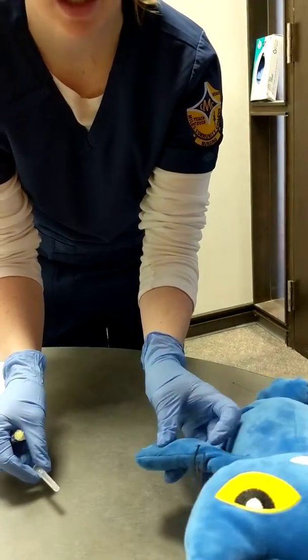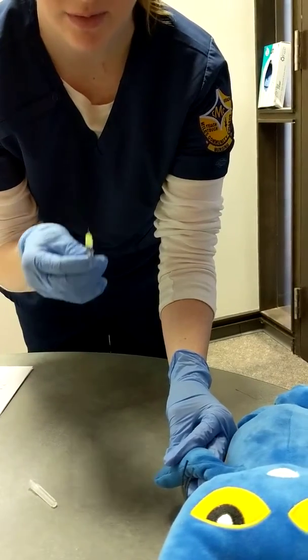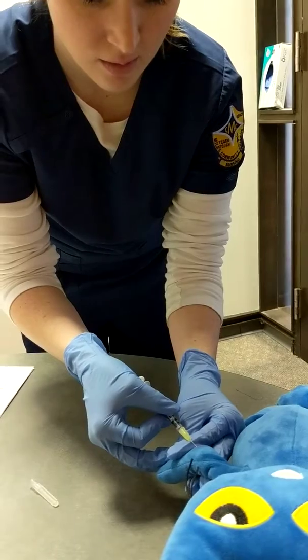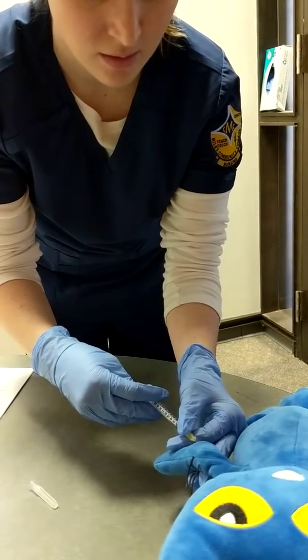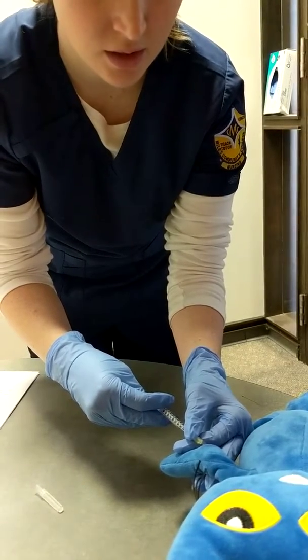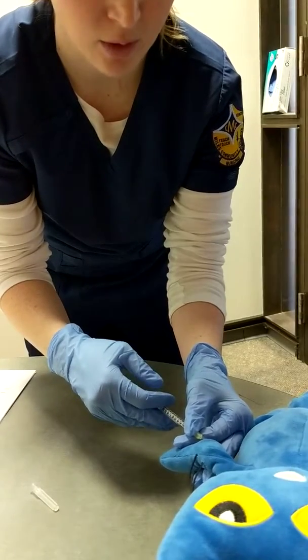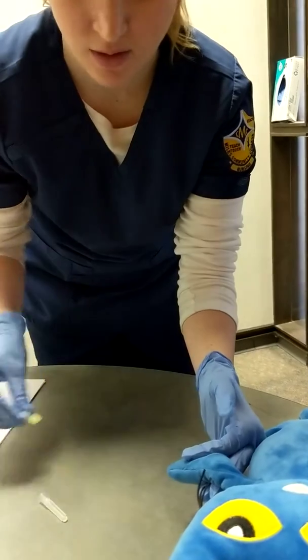And then we give this medication at a 5 to 15 degree angle with our bevel up. We go just under the skin. And we would want to see a 1/4 inch wheal or bleb. We'd only go 1/8 of an inch of our needle and pull it out.